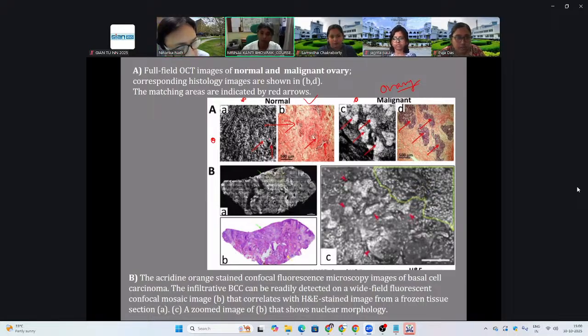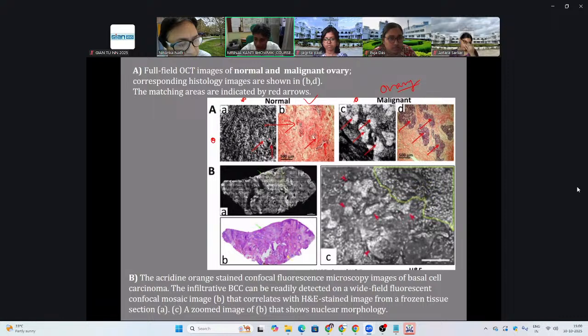From these cells, totally a lot of cells, the combination of cells is called histopathological images. So other than the cells, what are the different components in the histopathological image that is seen in the microscope by the pathologist or the cell biologist?